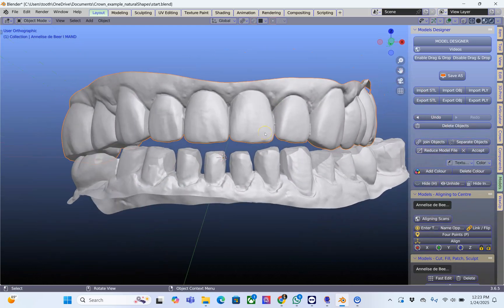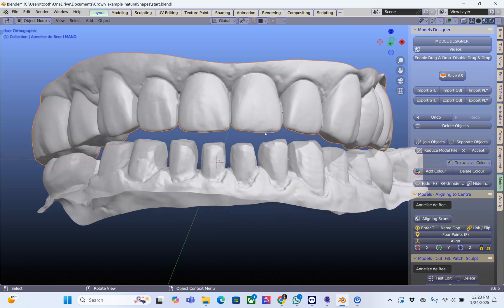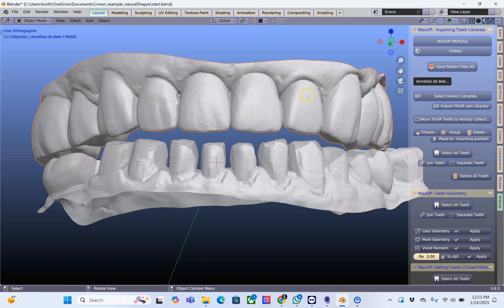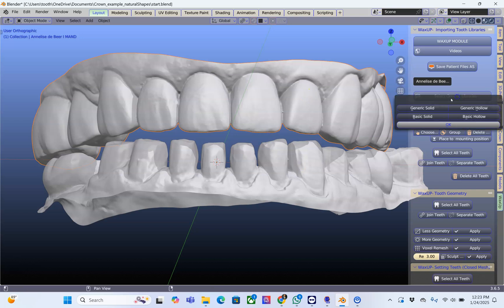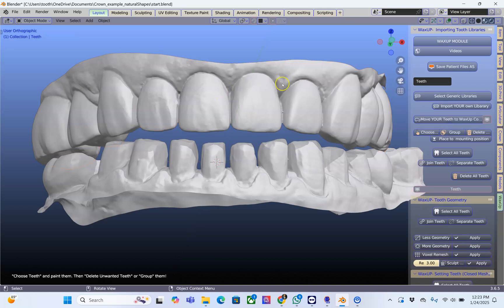Before we make crowns or veneers it's always good to do the staging at the beginning and not at the end. Here we've brought up a lower model and we're going to bring in some teeth. If you have your own tooth library you can bring them in as well by using File > Import STL and then move your teeth to the wax-up collection.